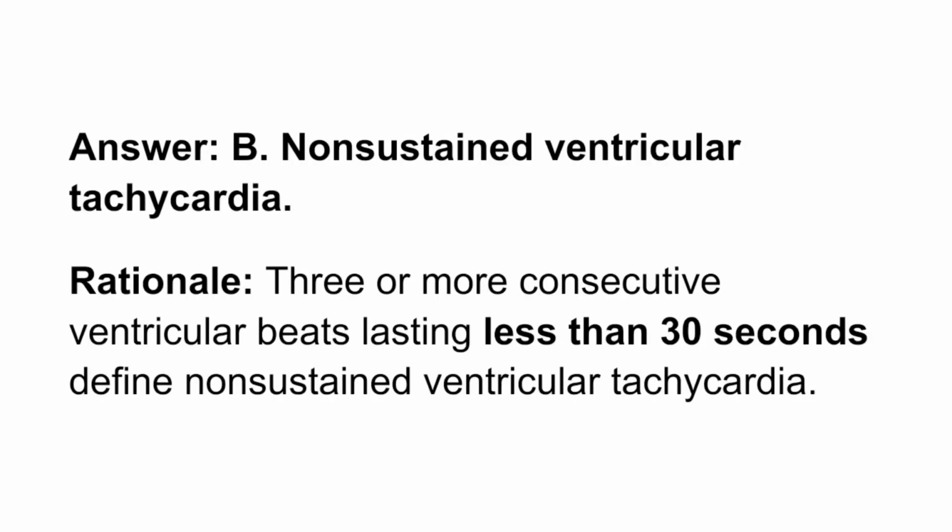Answer: B. Non-sustained ventricular tachycardia. Rationale: 3 or more consecutive ventricular beats lasting less than 30 seconds define non-sustained ventricular tachycardia.